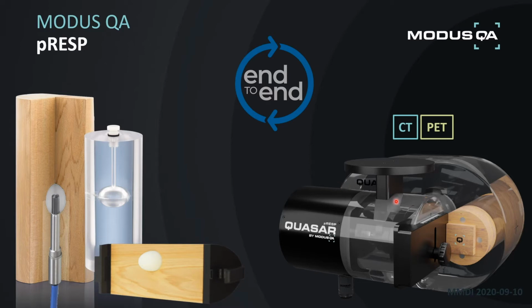And one highlight I wanted to include was the chest wall platform. So this chest wall platform can accept modification for any SGRT system to be able to track the motion of the chest, and then that will be corresponded with internal motion of the tumor itself, or sorry, the insert itself, which can have tumor models within it.